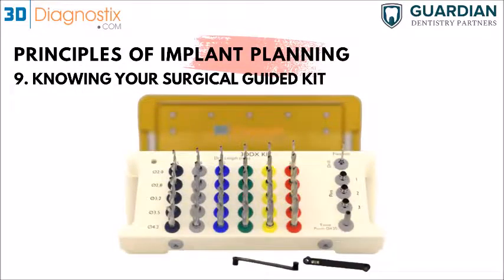Finally, and this would be my personal recommendation, know the surgical kit you're going to be using. Know the components in the tray and know how to use them, because if you find out the bone is too soft, you may want to underprep the osteotomy. You can decide to skip one drill, or use it just for the coronal third or middle third. Some kits have many components, and these components will help you make sure that the osteotomy is good enough for the implant to be stable.